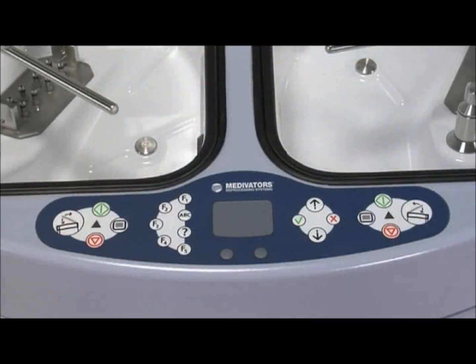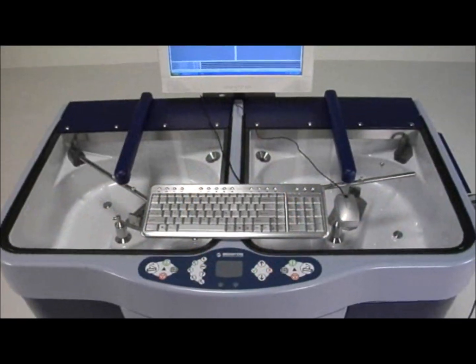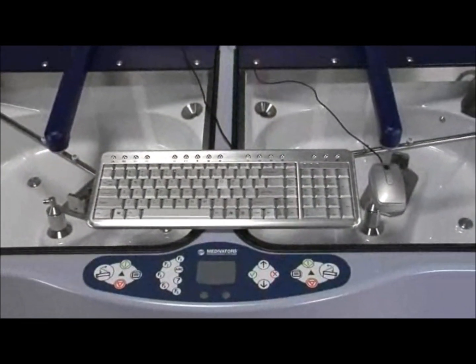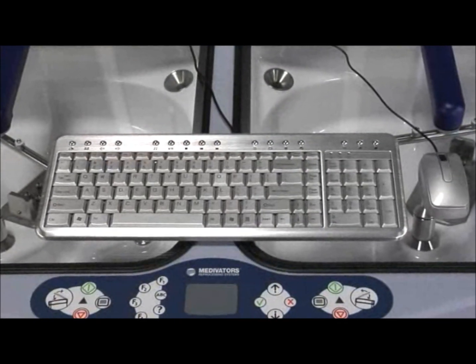The control panel consists of function keys, selection buttons, and a touchpad and mouse buttons. A keyboard and mouse are also supplied with the Advantage Plus and can be connected for use when entering user information.